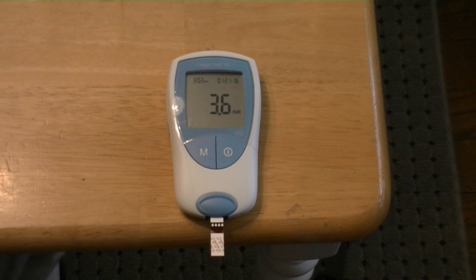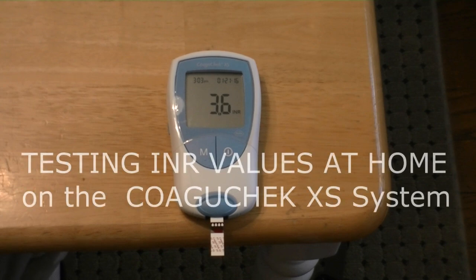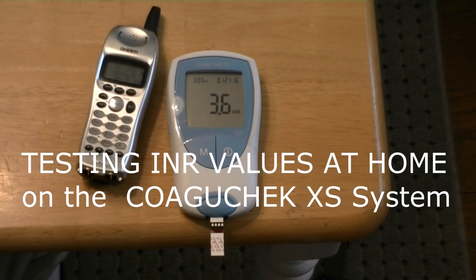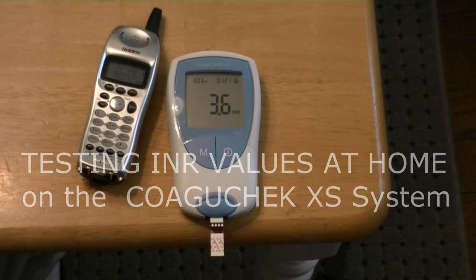3.6 does not concern me. Anything over 4 is cause for immediate concern. At 3.6, I know he's going to tell me to adjust my levels on what I'm taking, or eat a salad. This will be transmitted — I have to dial it in on the telephone. The computer will then take the information, disseminate it, and fax a report over to my doctor. He will give me a call, most likely sometime tomorrow, and tell me what to adjust to. And that's how you do an INR check.